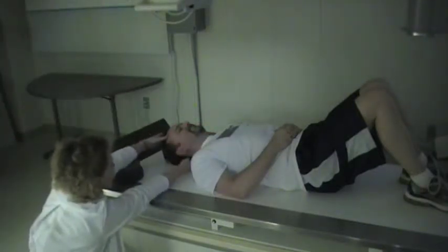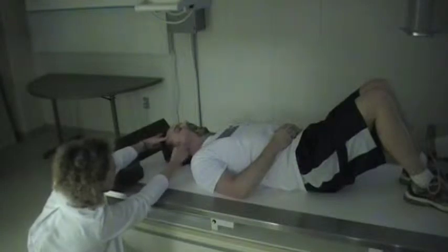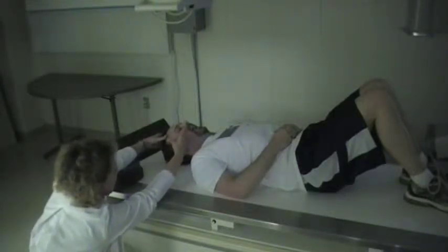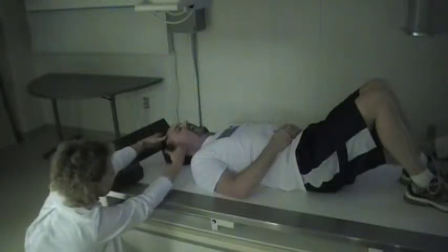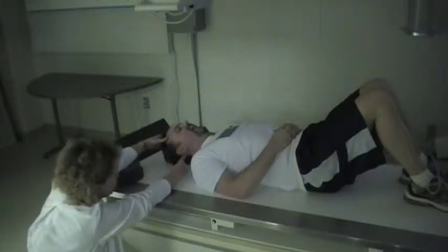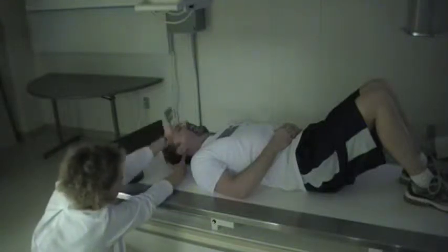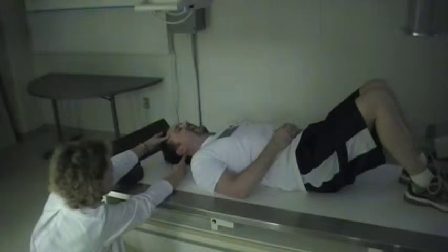Have the patient open their mouth. There are the top teeth — you just make a line from the bottom of those top teeth all the way down. Here's his mastoid tip. That seems to be in alignment with each other, so that's a good position.